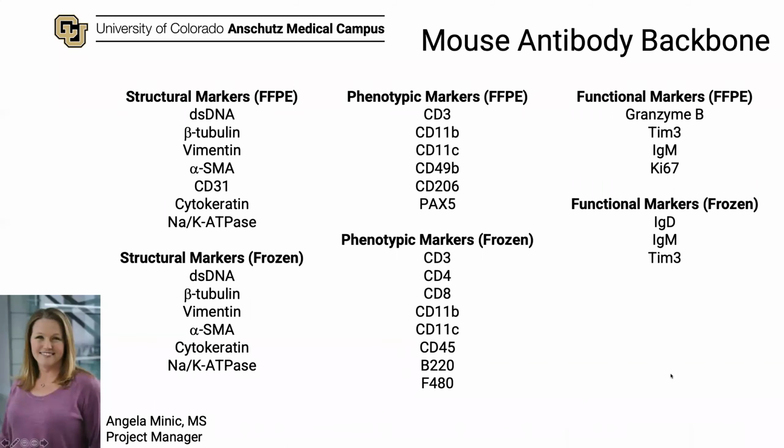These are the antibodies that IonPath has released and that we can buy off the shelf. They've separated their antibodies into FFPE and frozen specific antibodies. They don't have the corresponding frozen release for human tissue because it's pretty rare to get fresh frozen human tissue, much more likely that people will have FFPE to work with.